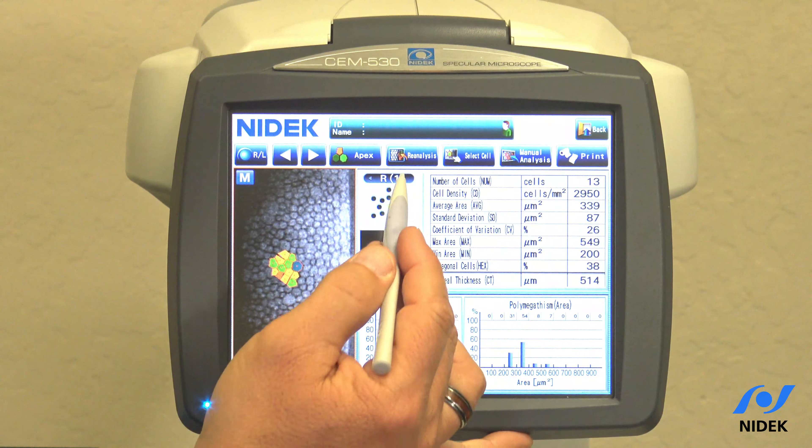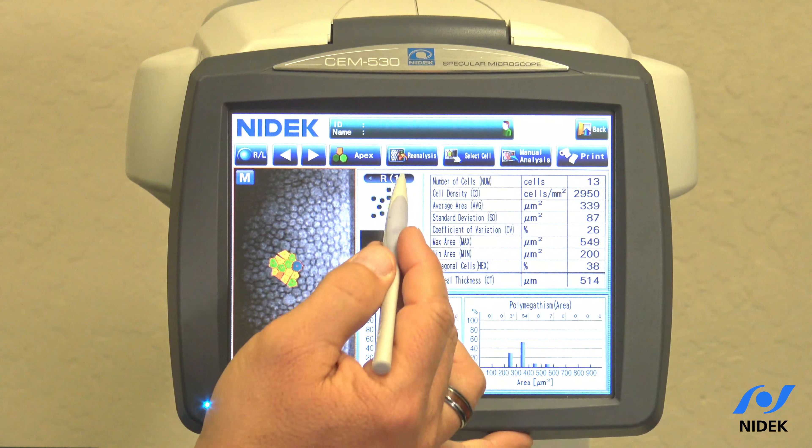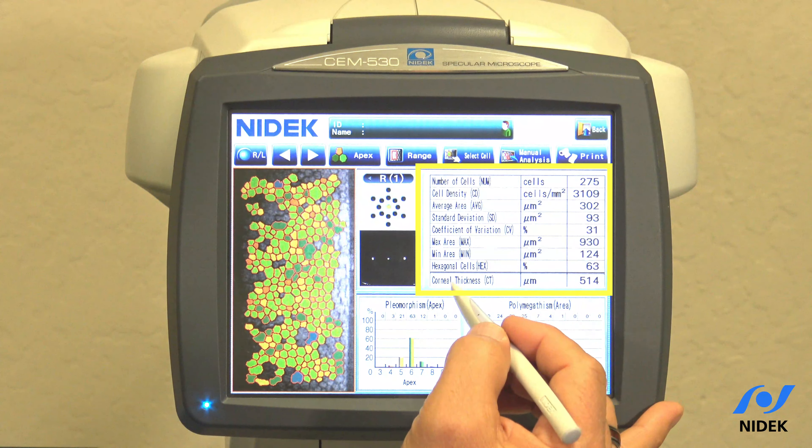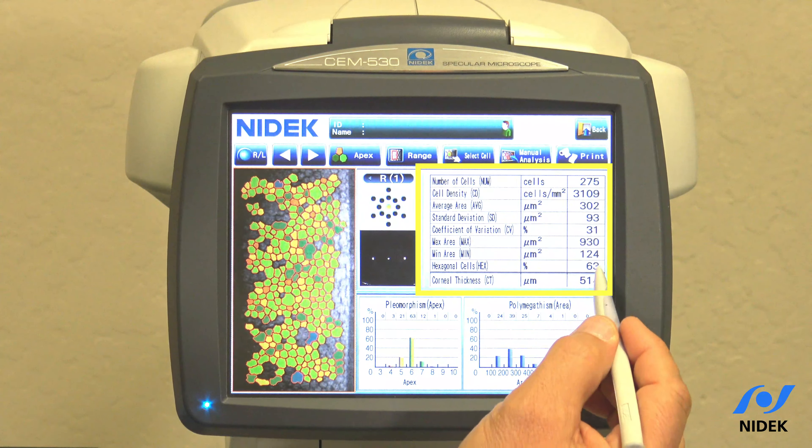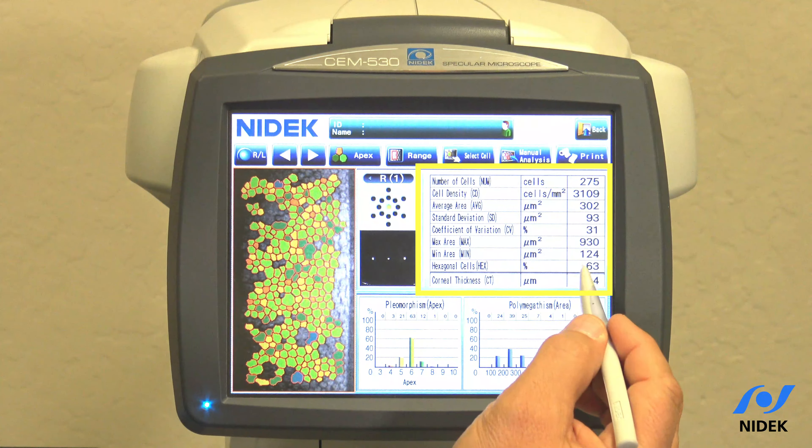The coefficient of variation in percentage is the standard deviation divided by the calculated average. This max area is the largest area of endothelium analyzed. Minimum area is the smallest area analyzed. Hexagonal cells percentage is the percentage of hexagonal cells, and then corneal thickness.